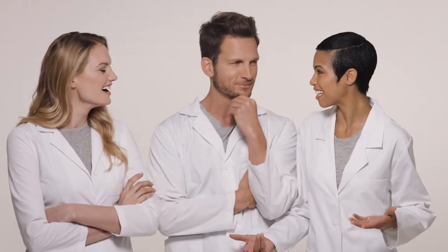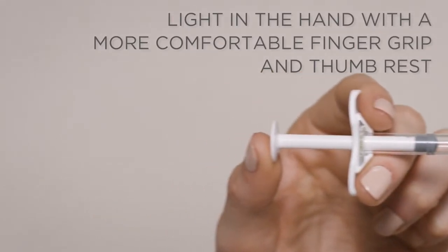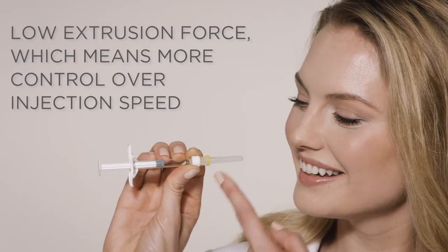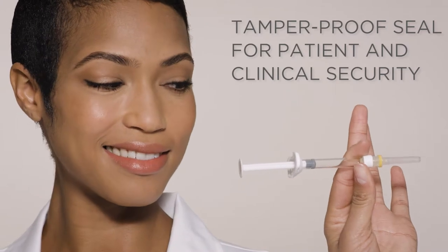So we know what you're thinking — what's so great about this new syringe anyway? The syringe is easy to use, has ergonomic flow, and has improved safety measures.